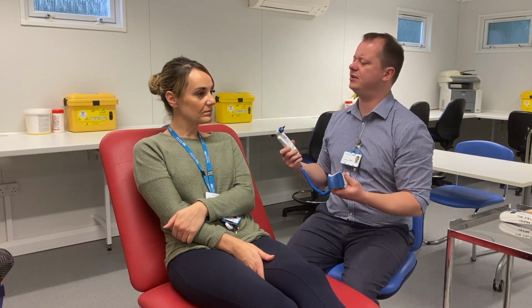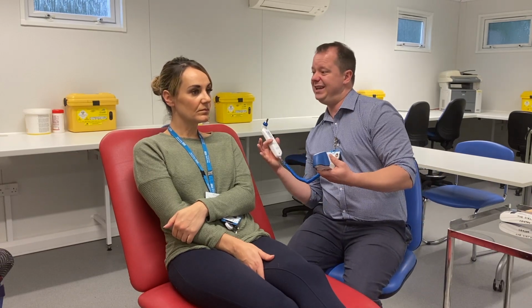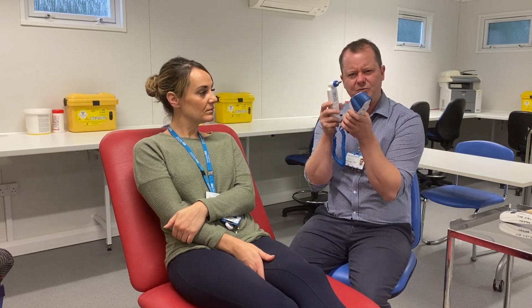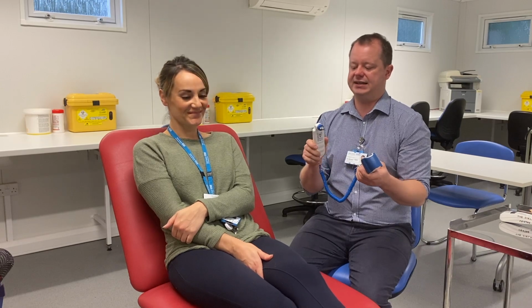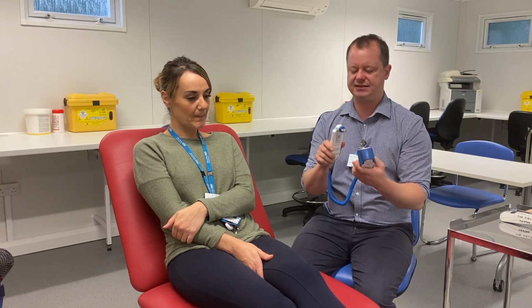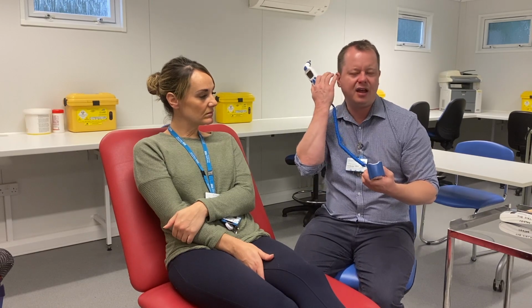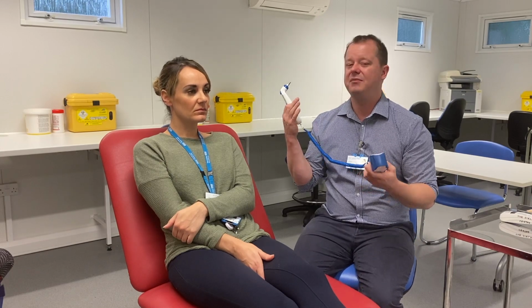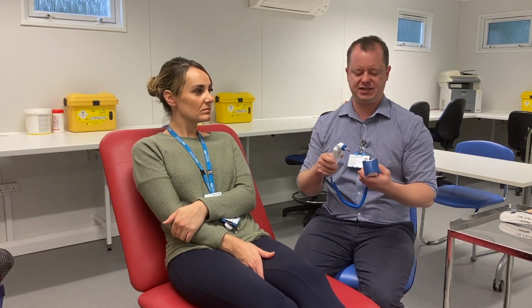Before you take the temperature of the patient, you can ask them which ear they prefer you to use. You'd also make sure the ear's clean and there's no discharge or inflammation. Also make sure that your machine is in good working order, that it's not like a wire sticking out of it or it's leaking somehow or covered in mess. Once we've done that, we also need to think about have they had something that's been covering their ear, like a hearing aid or something, because if they take it off, obviously the ear will be slightly warmer because it's been insulated, so we need to make sure we take that away and let the ear air before we actually take the temperature.